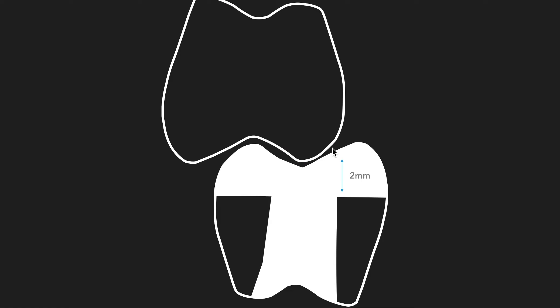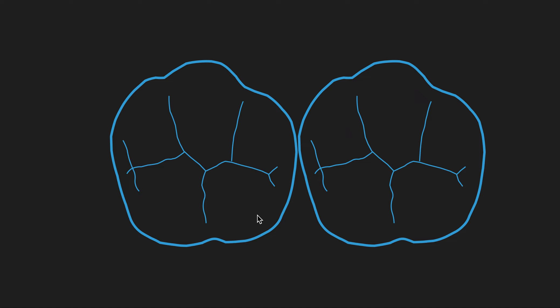Back to the specifications of this preparation: we need to remove at least two millimeters of the occlusal plane — don't go cheap on the occlusal reduction. Make sure you go two millimeters. One tip my buddy Major taught me was to round out any of the corners, which prevents sharp angles and makes carving these restorations a lot simpler, because there's less likelihood of fracturing off a piece of amalgam.